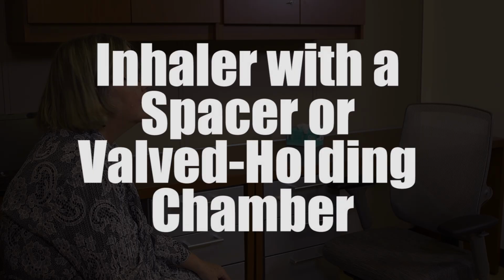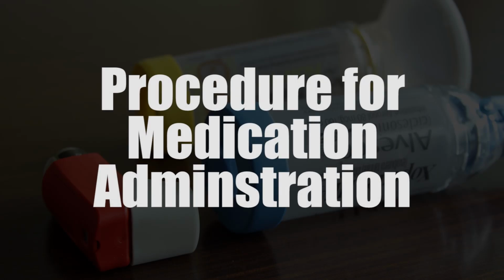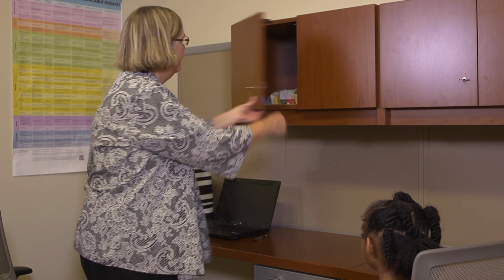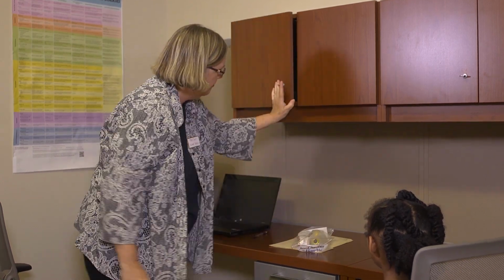Inhaler with a spacer or valved holding chamber. Things to consider: attempt to provide the student with as much privacy as possible, given the urgency of the situation. Procedure for medication administration. Gather needed supplies and place on a clean surface.